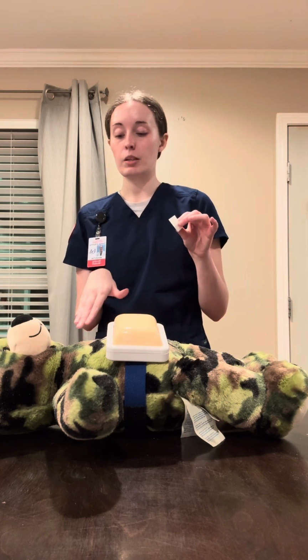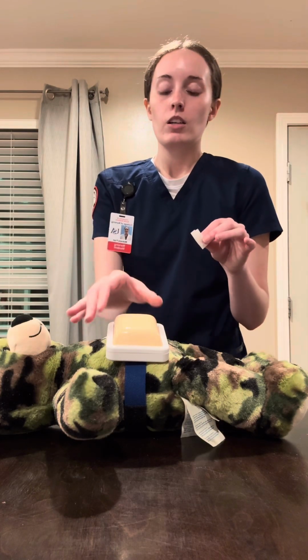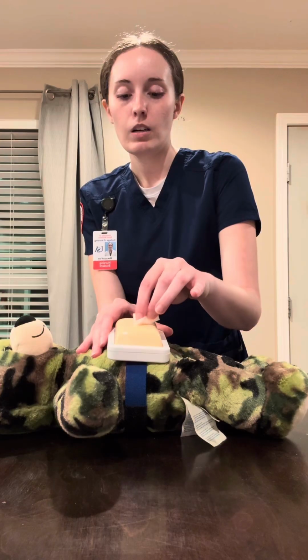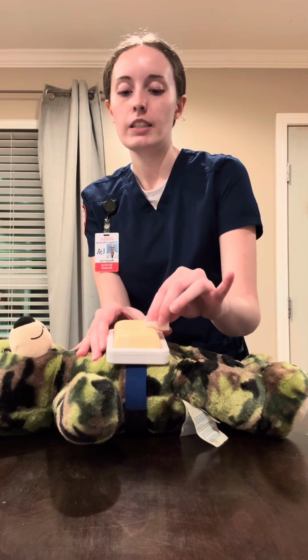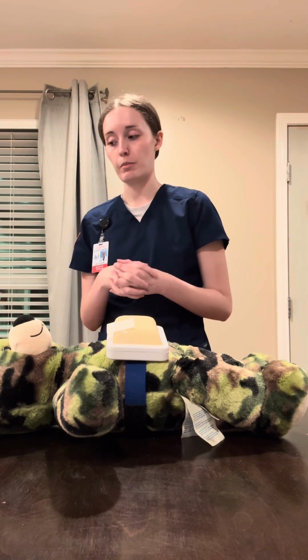The heparin subcutaneous shot is given in the abdomen area. I should avoid 1.5 to 2 inches around the umbilicus. Okay, Mr. Jones, this might be a little cold. Clean, clean, clean. I'm going to leave this there to dry before I inject the heparin.